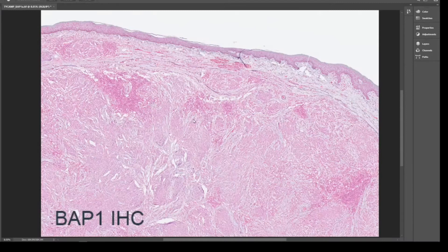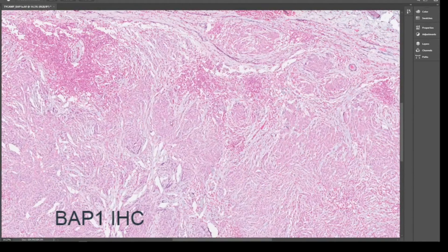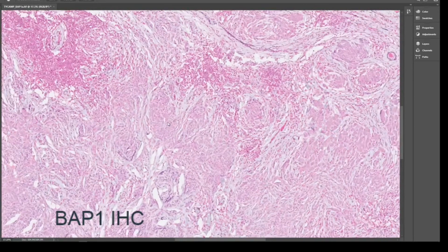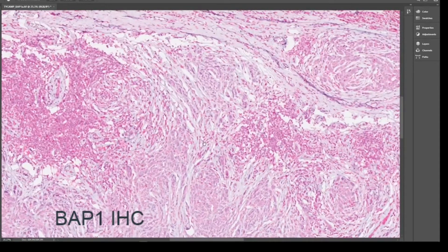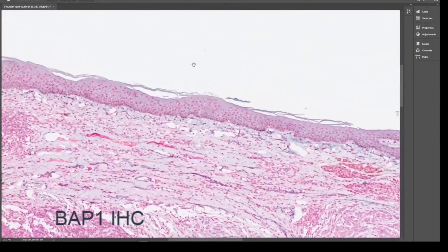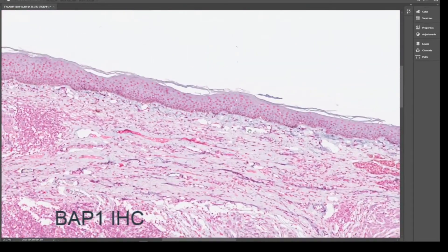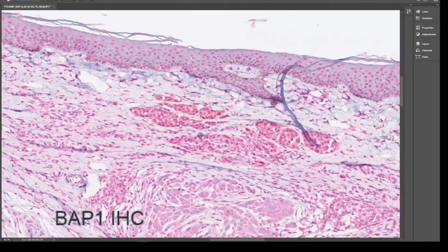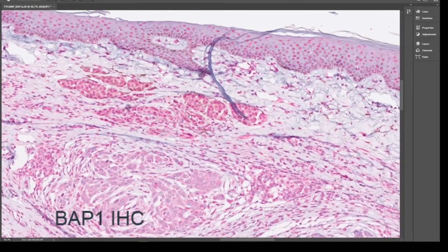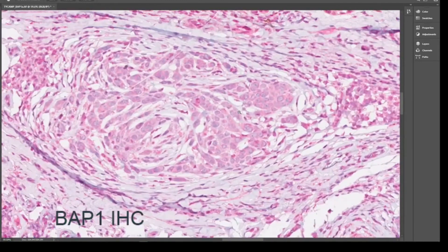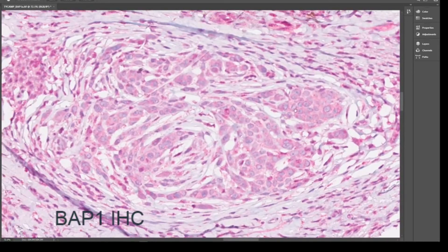Moving to BAP1 immunohistochemistry, it should only take you a few seconds to see that there is a loss of expression in the nuclei inside the clone. There will be positive controls in the lymphocytes as well as in the keratinocytes, and there can also be some positivity where there are the bland remnants shown previously. There is also some degree of cytoplasmic staining with BAP1, which is not constant.